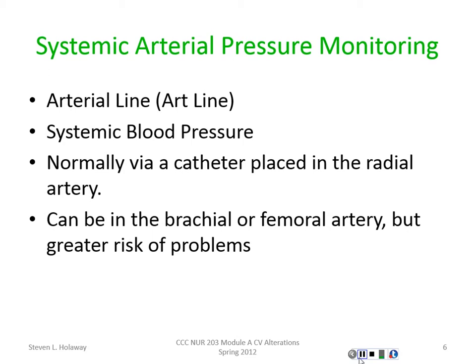Now what kind of problems can you see if you're actually putting a catheter into the artery in that area? Bleeding? Absolutely, bleeding. Infection? Yes, absolutely.